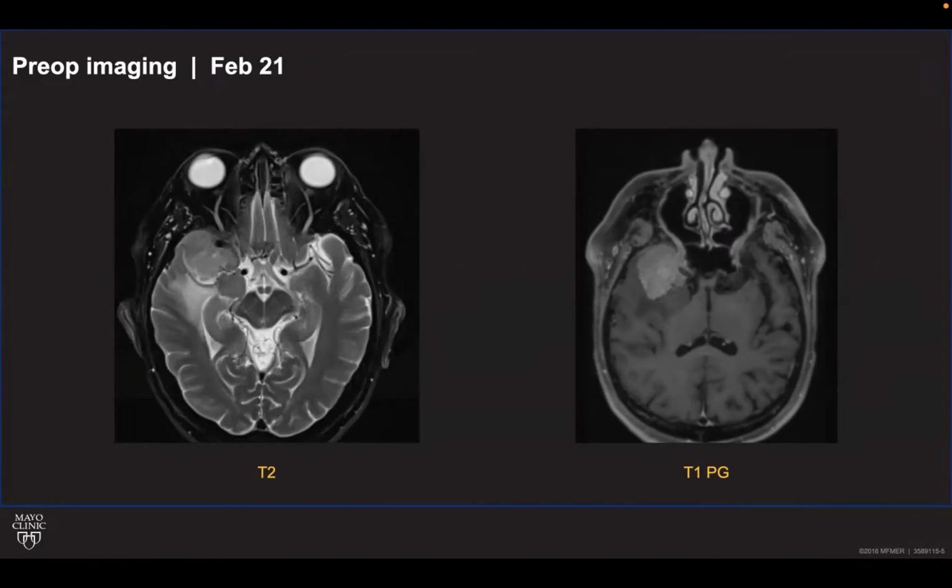What else? The other thing that narrows the differential from a radiology standpoint is that, take a look at the bone. So oftentimes it's helpful to see the CT scan. If that bone is hyperostotic, if it's thickened, that leads towards the meningioma as well. Calcifications within the tumor are helpful as well. So we tend to go with the MRI because it's the workhorse, and the images are prettier. But I think if you use CT and MRI in conjunction, that helps as well. Obviously, if the bone was destroyed, eroded, or irregular, that would make you worry about metastatic disease as well. And so then you're going to look a little bit closer in the rest of the body. But again, you did a great job with the radiology description.